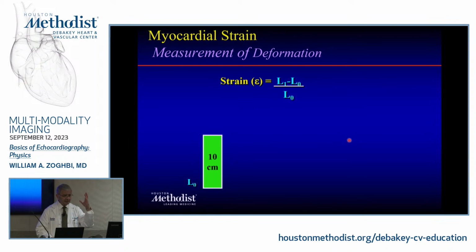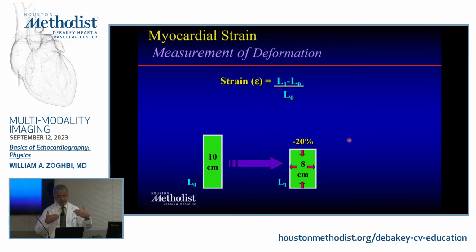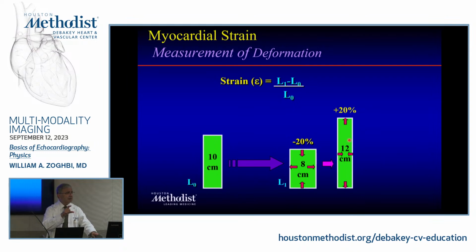So the muscle, let's take a longitudinal strain. It deforms from a resting state, conceivably gets compressed. It's hard to measure it in 3D completely, so you bisect it in a way. It's vectors. So in this vector, it has shortened by about 20%, yet it has widened on the other side. And if it's stretched longer, let's say it relaxed by 20%. So it's the delta between L and what L0 was at baseline, right?